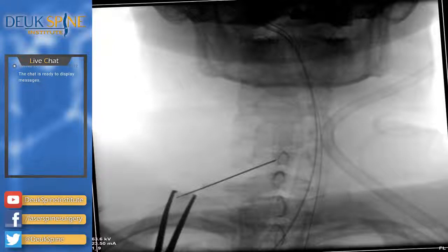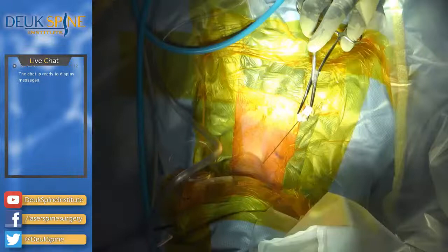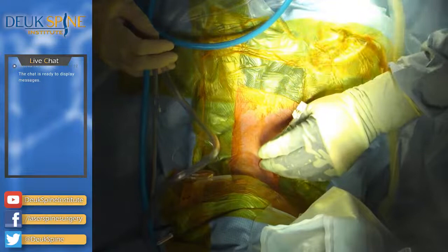I'm Dr. Deuk Majan. We are at the Deuk Spine Institute. We're performing a repair of a herniated disc in the cervical spine at C5-C6. It is by far the most common herniated disc. Number 5-6.